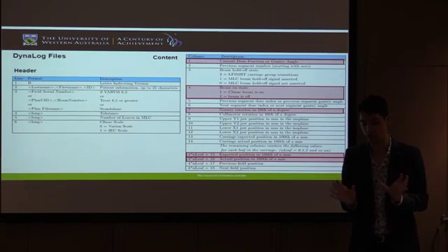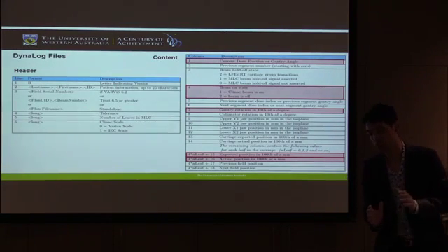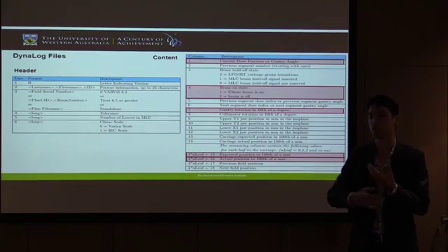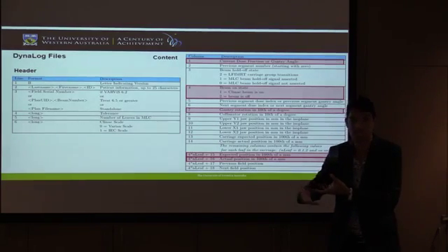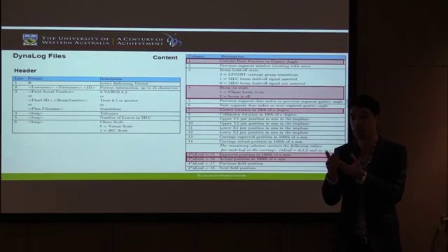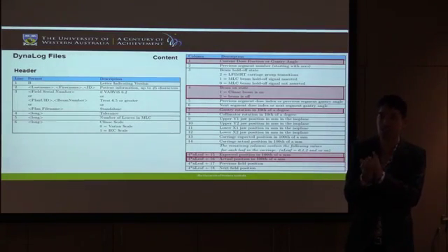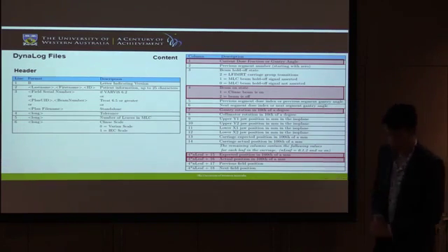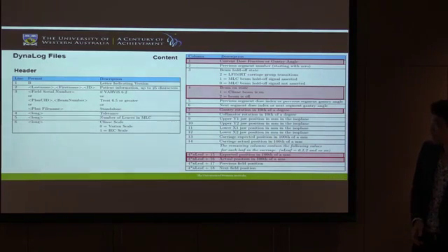Between the 2 banks, you've got a center line down the middle. If the leaf is retracted back from the center line, it has a negative value. If it's extended over the center line, it has a positive value. For example, -2 millimeters means that it's retracted 2 millimeters from the center line. That's just how it is.